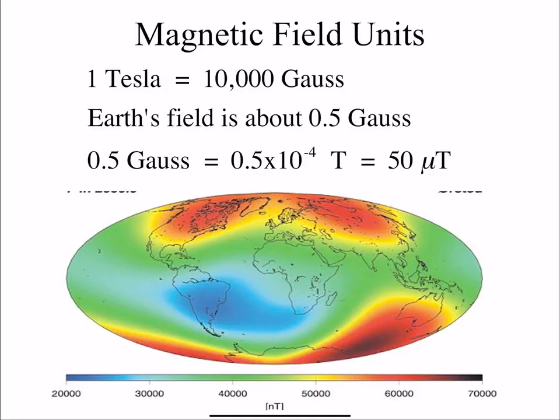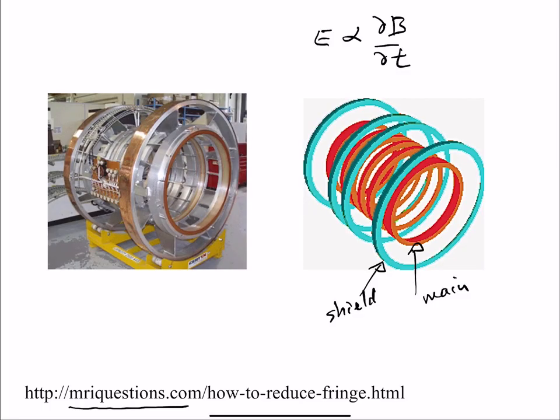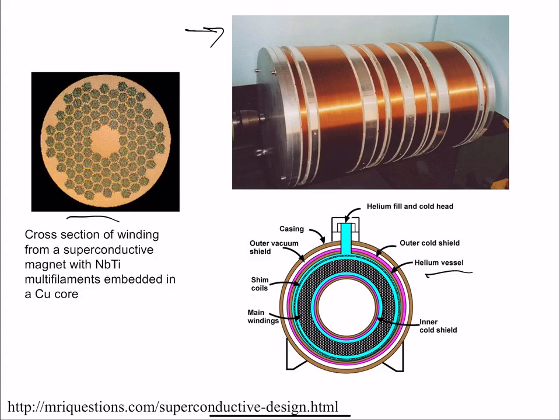Question: And that liquid helium is just a one-time setup at the beginning? Yeah, hopefully yes. With the modern magnets, anytime you go into an MRI system, you hear this pumping sound, pum pum pum. That's not the magnet. That's them trying to recover the helium. As the helium boils off, they recondense it, so you don't need much helium. Now, if things go wrong, then sometimes you need a helium refill. But ideally, if everything's working, you can recover most of it.